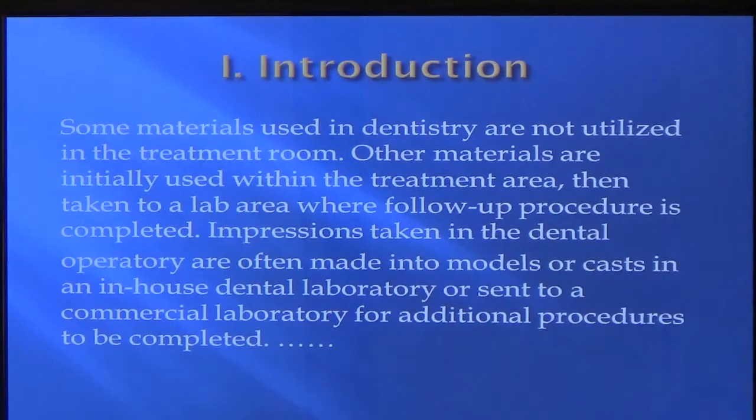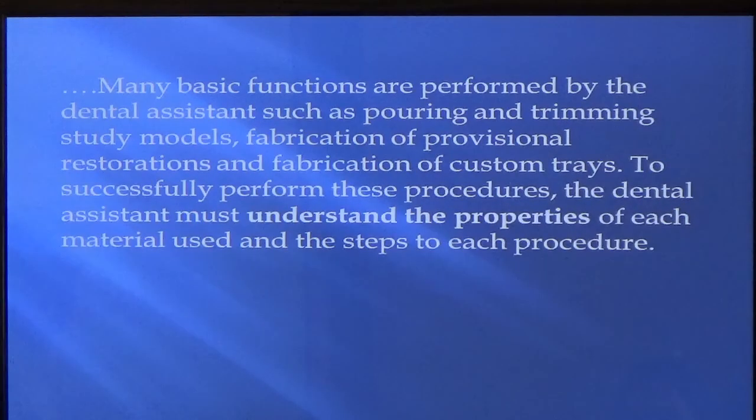So again, some materials used in dentistry are not utilized in the treatment room. Other materials are initially used within the treatment area, then taken to the lab, which is what we do here, to do other procedures and complete the procedure. Impressions taken in the dental operatory are often made into models or cast in the in-house dental laboratory or sent to a commercial lab for procedures. So you take the impression in the operatory and then you bring it to the lab here or there, and we pour it up and make the models.